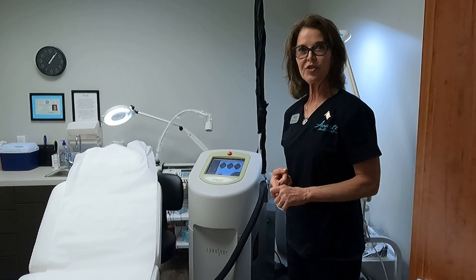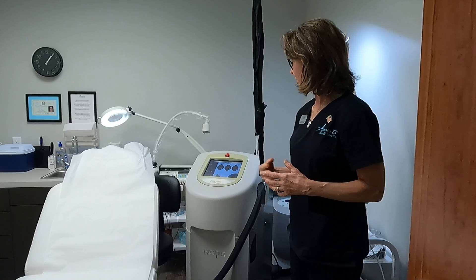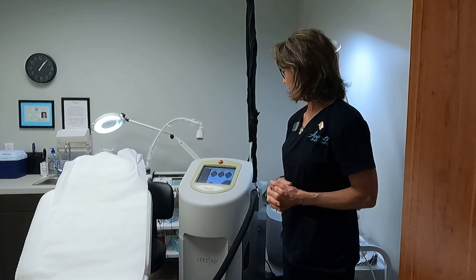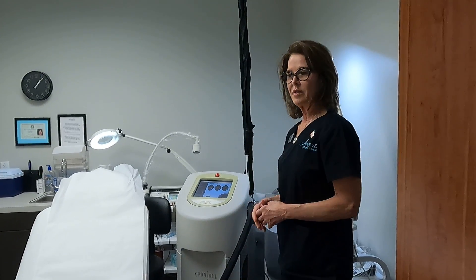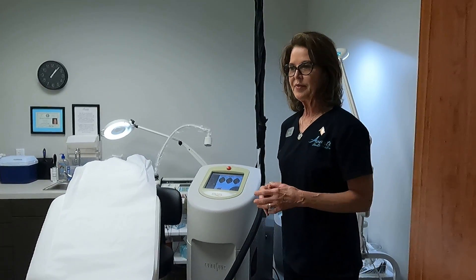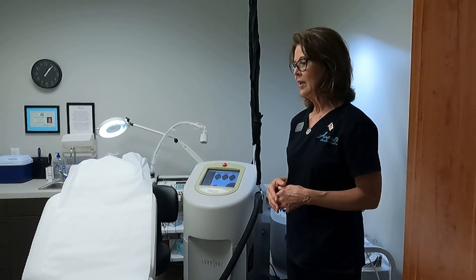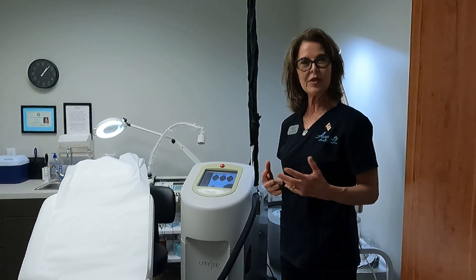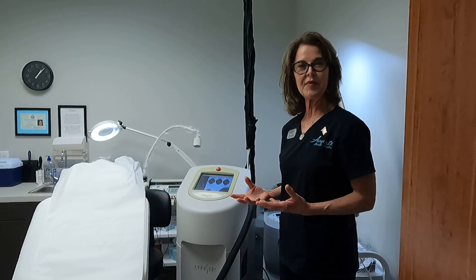The Candela Gentlemax Pro uses the cryogen spray, which really does a great job of cooling the skin during treatment. The Elite MPX adds the Zimmer chiller. This particular device has the chiller in the same box with the laser, whereas many of the other Apogee Elites have a separate standalone Zimmer chiller. Clients really like the cooling by way of cold air, and they sometimes have a preference of one cooling method over the other, so we can offer that to them.